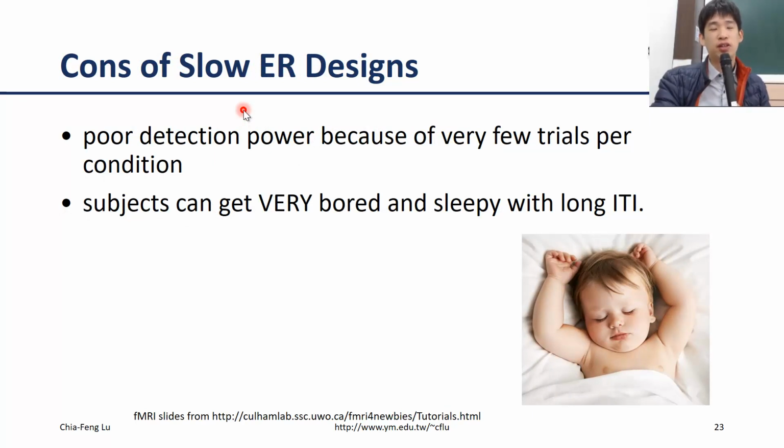However, the cons are much greater than the pros actually, because it has a very poor detection power, because you can only allow very, very few trials within a certain scan time. For example, in 10 minutes, you may only have maybe 10 or 20 trials. Compared to block design, it's a very, very small number.